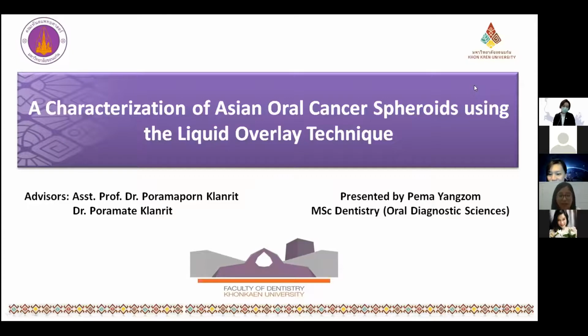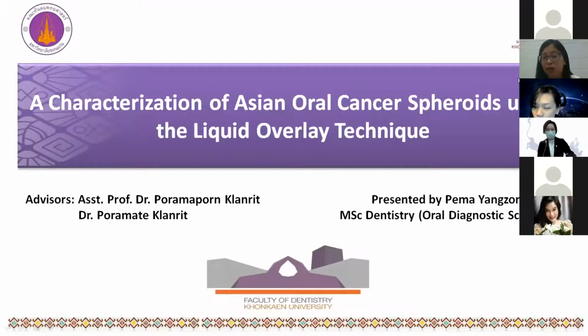Of course, it's part and parcel of laboratory cell culture. But I experienced it particularly when I was growing them as a monolayer, Ajahn. I made sure that the 2D monolayer cell culture was not contaminated before I did the cell seeding for 3D culture. So I didn't observe contamination in spheroids, but I did observe contamination in 2D cell culture. So your spheroids are safe? Yes.